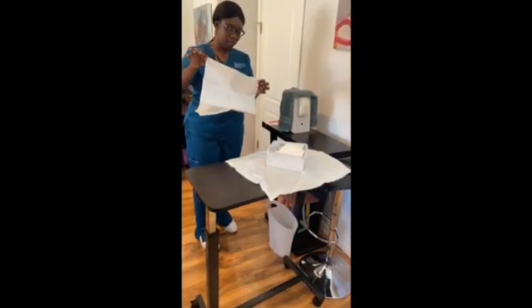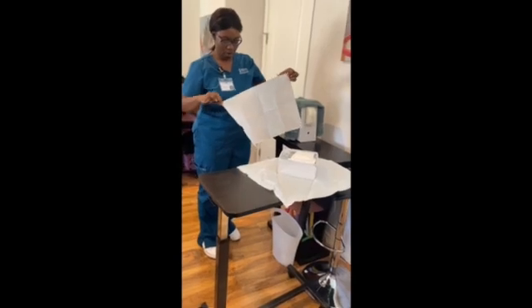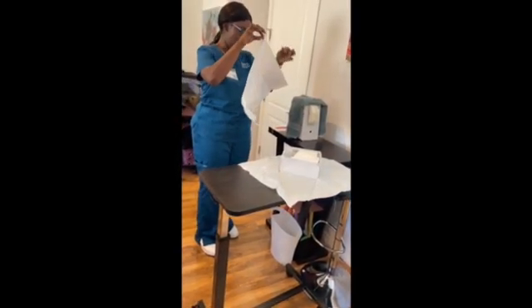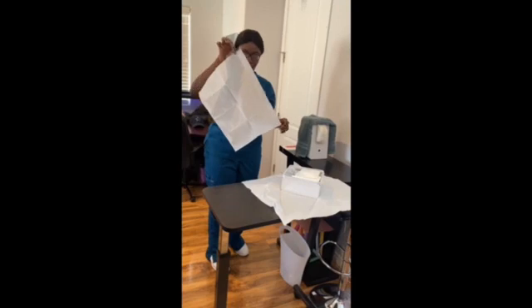Being careful just to touch the outer 1-inch corners. Making sure to place shiny side down.